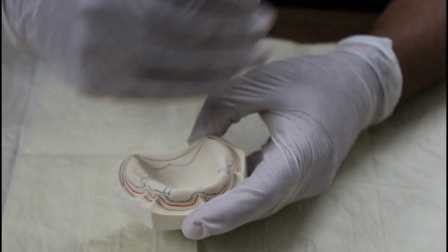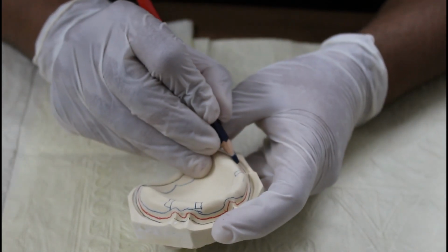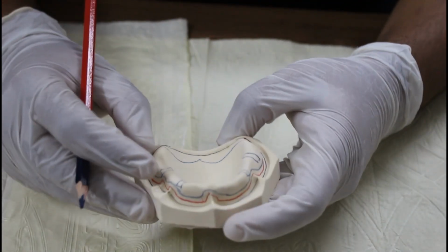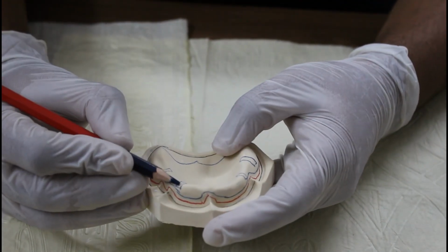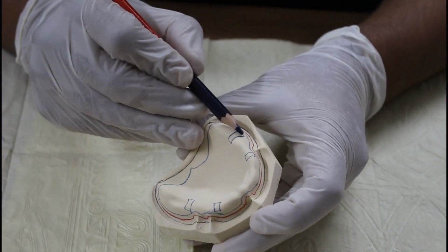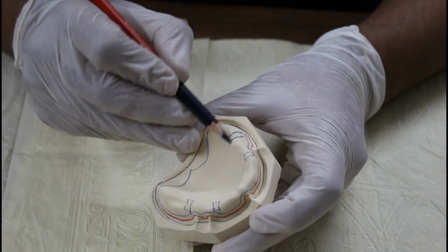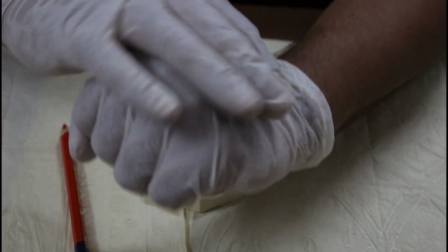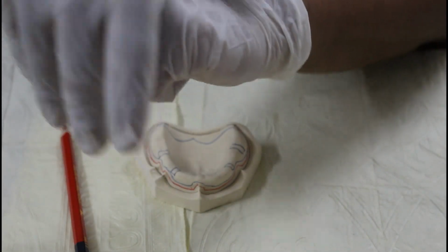One should not go ahead, one should not be back. Some books say you can make them 4 millimeter by 4 millimeter. Some books say you can make them 4 millimeter wide and covering the ridge. If this is the ridge, your stop should cover like this.